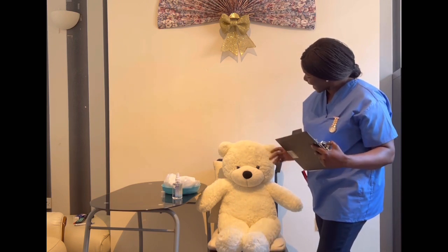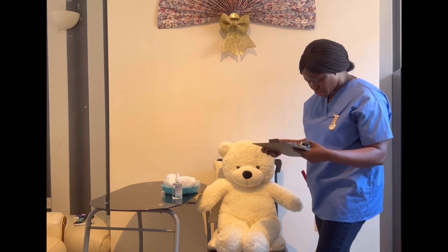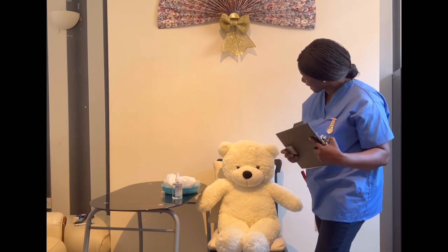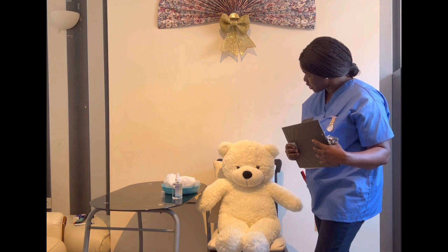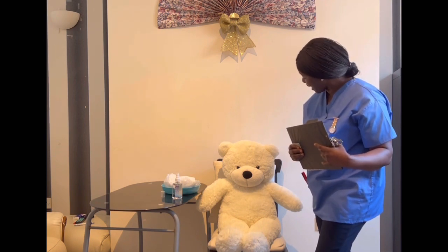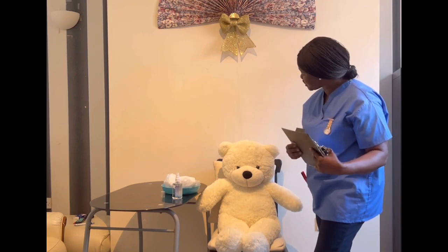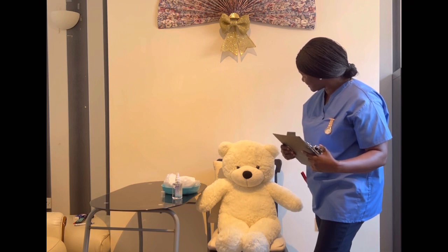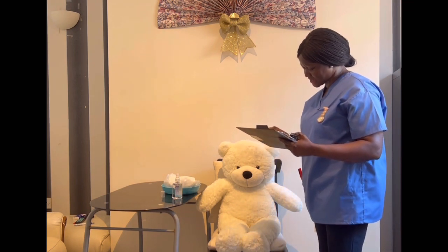Have you got any allergy you know of? Yeah, I'm allergic to latex. So sorry to hear that. And what happens to you when you have an encounter with latex? I start to get rashes all over my body. I want to assure you, Harry, throughout the course of your treatment, we're going to use latex-free materials for you. Is that fine? Oh, yes, thank you. And it is well documented that you are allergic to latex.